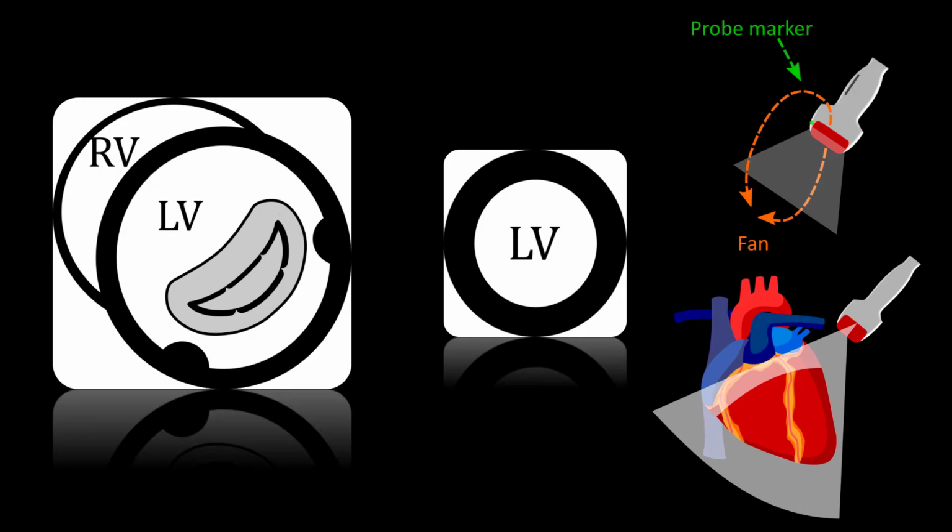The second view is the apical parasternal short axis view, helpful to better delineate clot if there is an apical akinesis. The coronary sinus can be seen as you get close to the base of the heart, and is often mistaken for an effusion. Differentiating it is quite simple. It will not progress much or at all past the junction between the two ventricles.